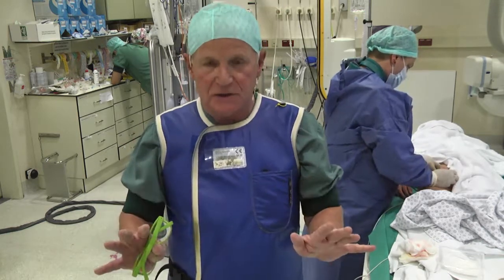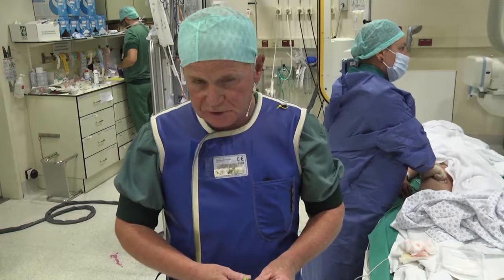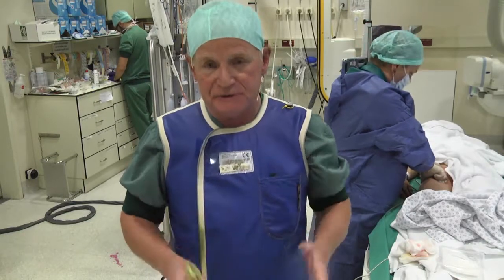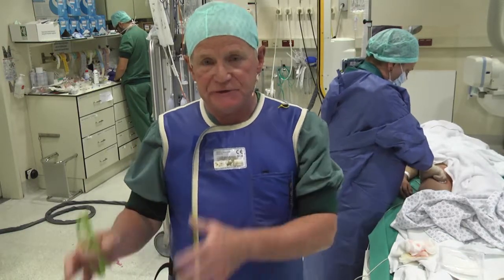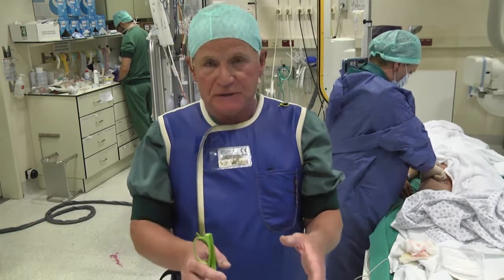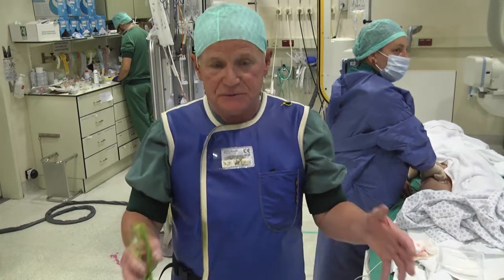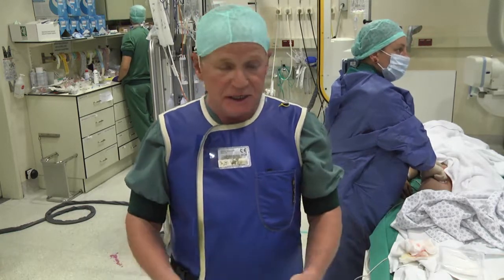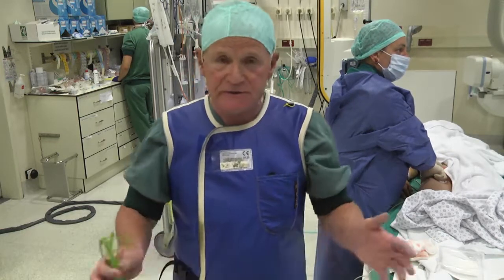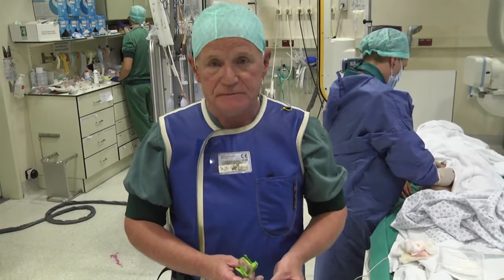There, I fully agree. The thing is, Andreas, you are also a proctor. I think everybody on the panel is a proctor. And the most embarrassing thing that can happen to us is to go to a center where they have just no more than the equipment you need to put in the valve. But once you start running into trouble, you need big sheaths, and not only a 24, even a 26, bigger sizes. You need a lot of equipment. Safety equipment in a cath lab is very important.